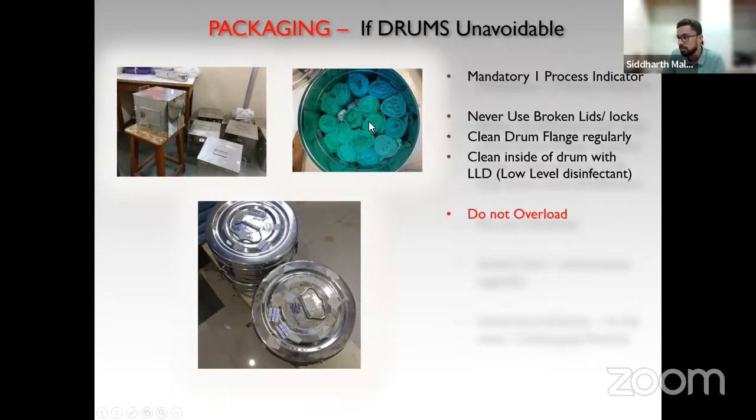There is place for steam to penetrate. See, these are the holes, if you can see over here. And if you are placing the linen over here, the air can be removed outside and steam can go inside. However, if you pack this thoroughly with linen, there will be very little space for steam to move around. That means sterilization is not going to be proper.